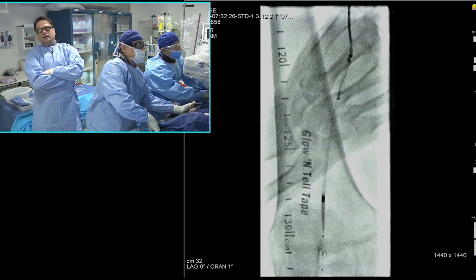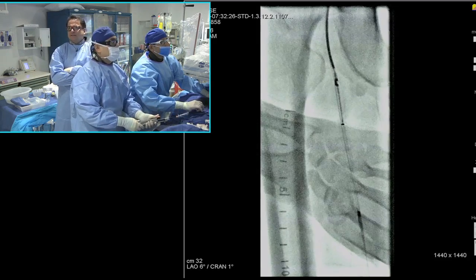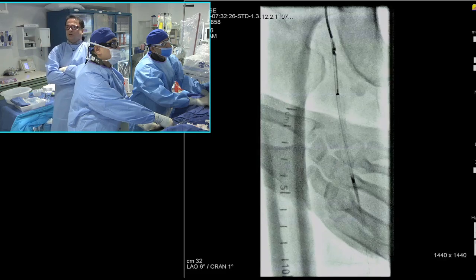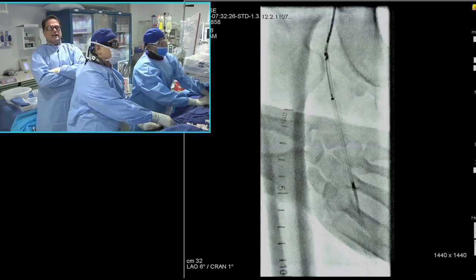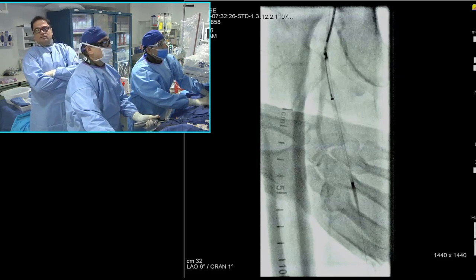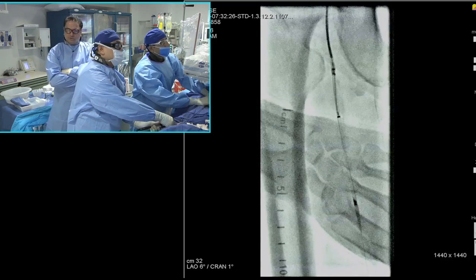I think number one, in all calcific lesions, when you're doing atherectomy, you should use a filter despite whatever device you decide to use. I'm being honest with you. You were there in our case at Link yesterday, you saw the amount of debris that we had in that filter, it really saved the day. Number two, any long segment atherectomy, such as anything above, say, 150, I'm going to throw out an arbitrary number, where you have a heavy plaque burden with single vessel runoff, I think you should use a filter.